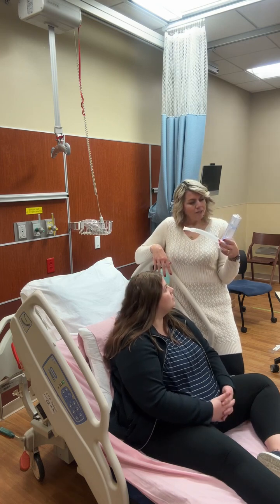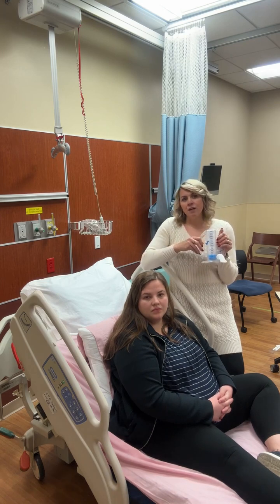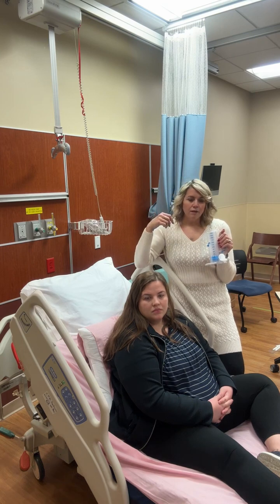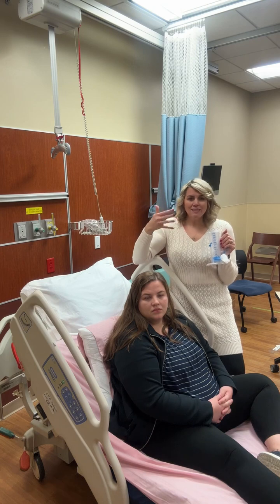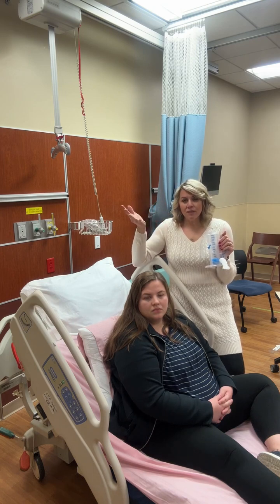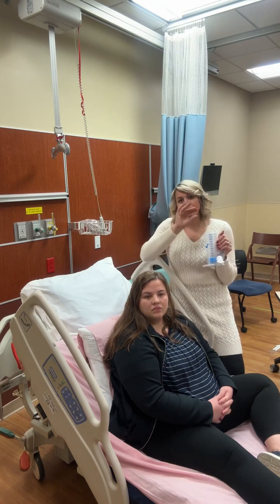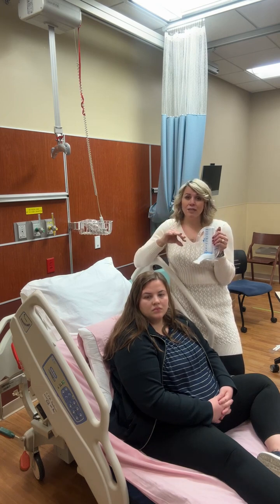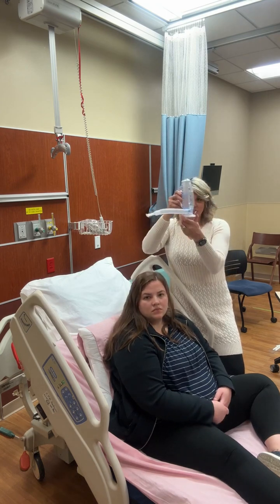So typically when you get one of these ordered from the doctor, they're going to say that we want the patient to do it 10 times an hour while awake, or it depends on what the situation is, but typically it's going to be 10 times an hour. But make sure you read your orders, because there are like 3 or 4 sims in the sim lab where there's a very specific number of repetitions for the patient to breathe on, okay? And so let's talk about what all this stuff means, all right?